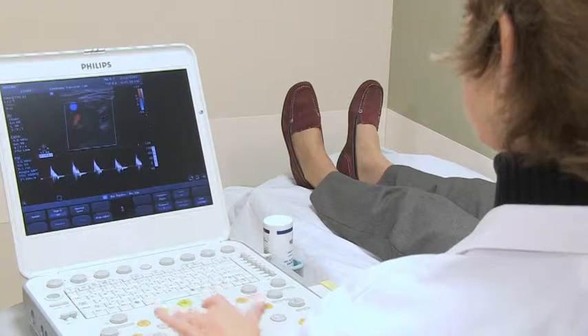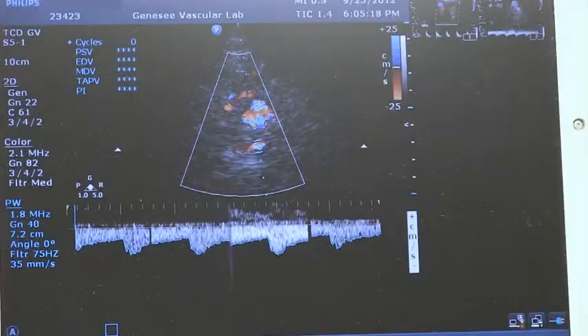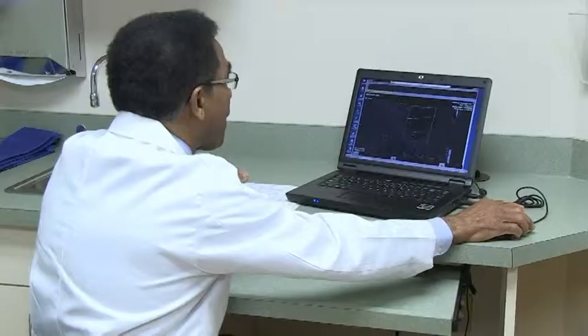Depending on your symptoms, your doctor may request that we look at a couple of additional arteries in the back of your head. This is called a transcranial doppler.